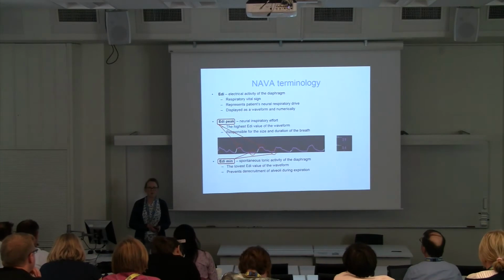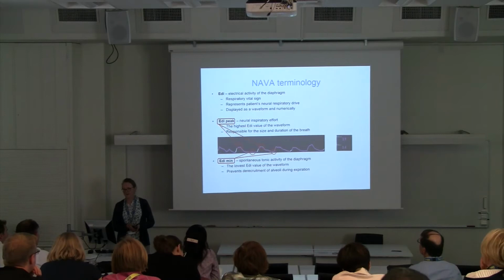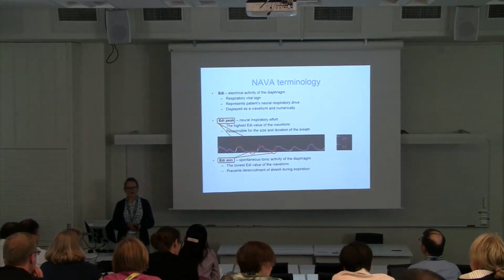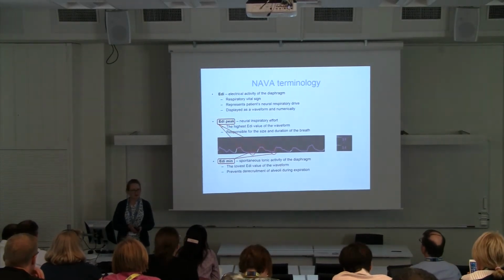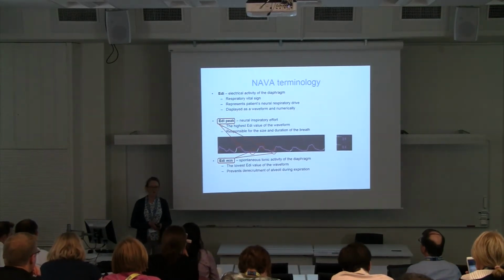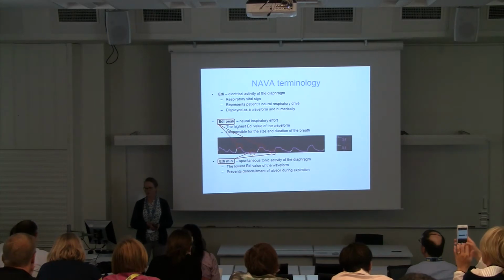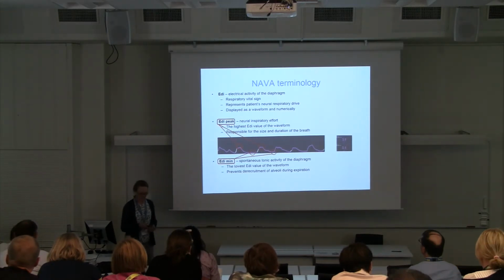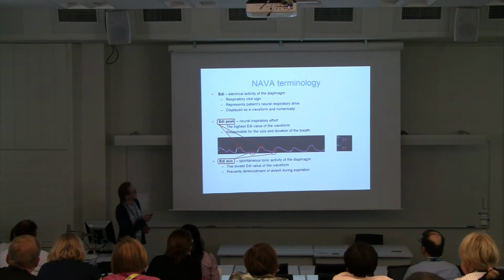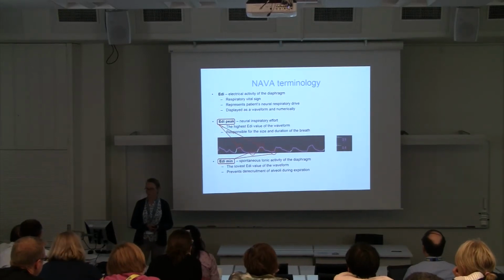Before we go any further, I need to go through some NAVA terminology. The EDI stands for electrical activity of the diaphragm, and it can be considered a respiratory vital sign. It represents the patient's neural respiratory drive, and it can be displayed as a waveform, as here, and also on the ventilator screen we can see the numbers.